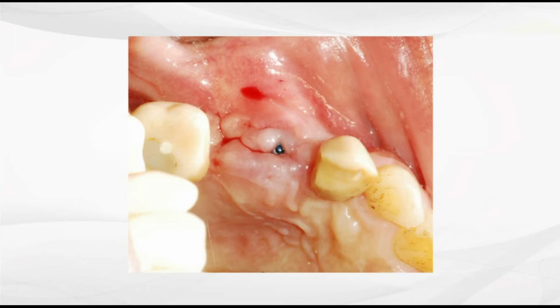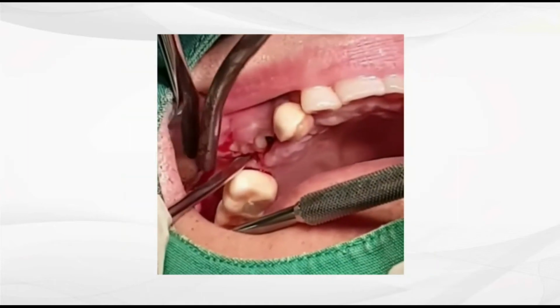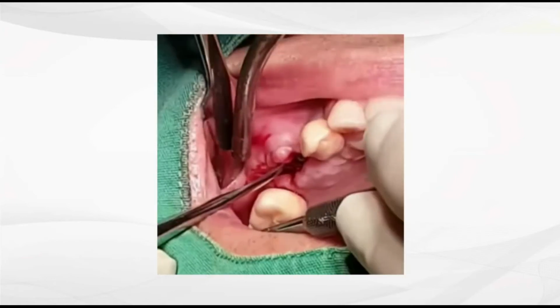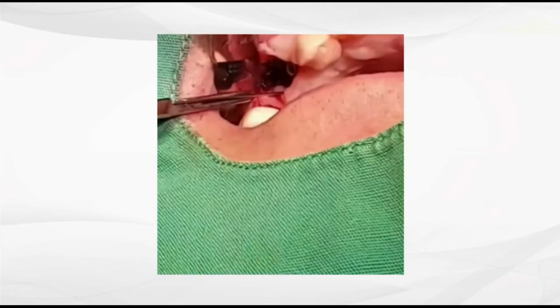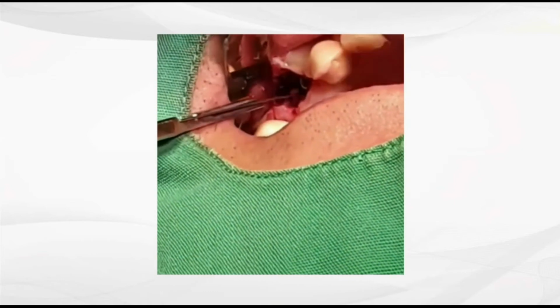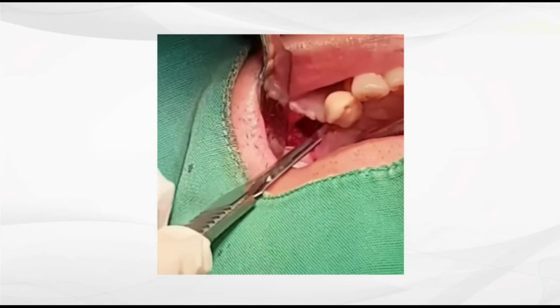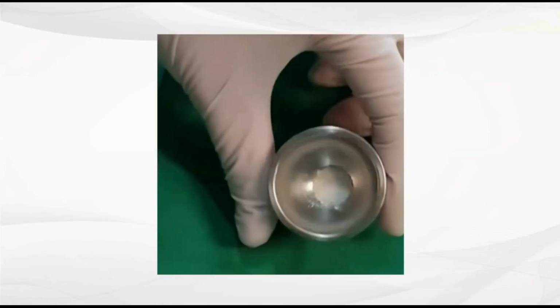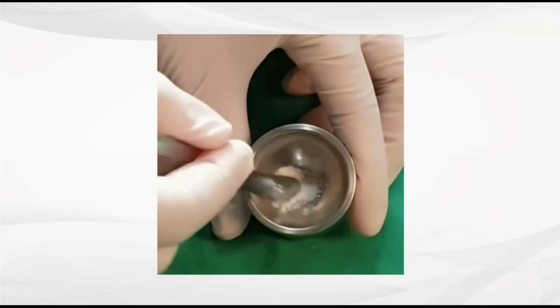From now on, let's see the ridge augmentation and GBR by applying Moldable AutoBT. Reopen the flap with a vertical incision, lightly remove the less mature granulation from the upper part, and remove the residual inflammation of the soft tissue by trimming it well. The flap is very easily reflected 10 days after the first surgery.